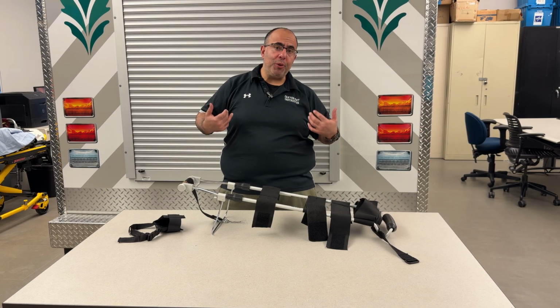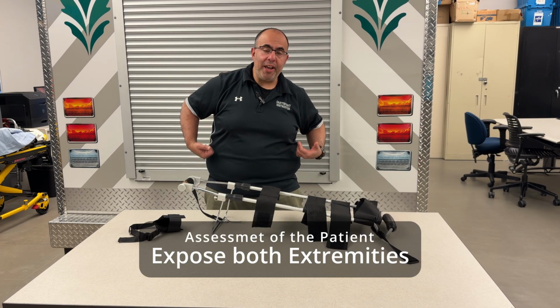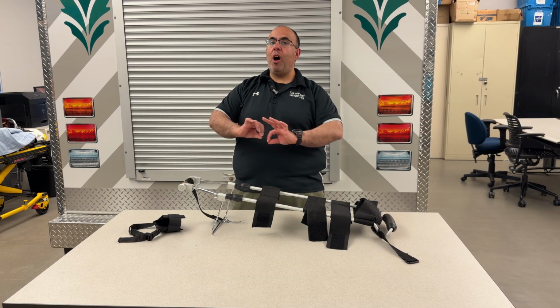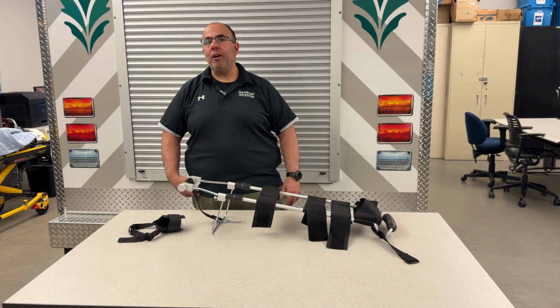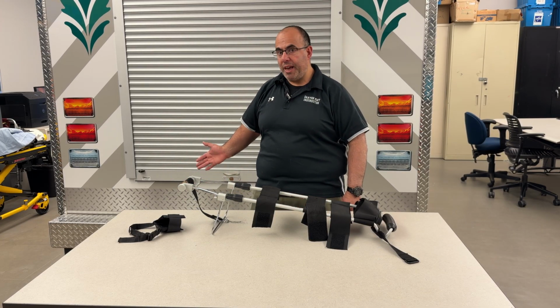Before you do any type of assessment and treatment of this patient, you want to expose both extremities, legs. You want to cut the pants on both sides, cut the socks, and cut the shoes off, and peel the shoes and the socks off like a banana, so you're not causing any more damage to the patient. With a closed mid-shaft femur fracture, the patient's leg is going to be shortened and then rotated outwards.